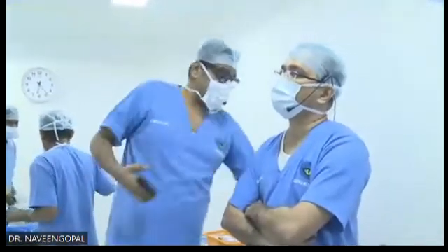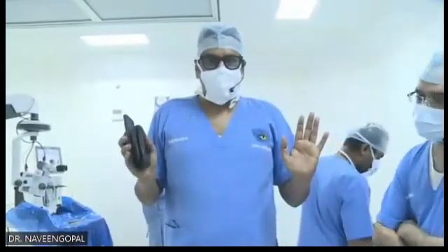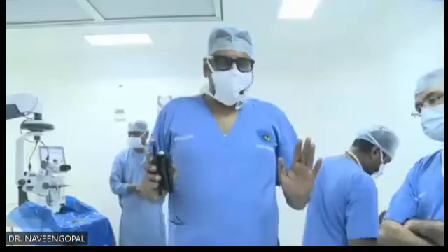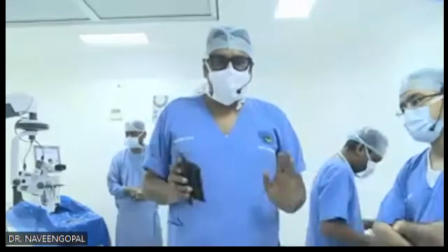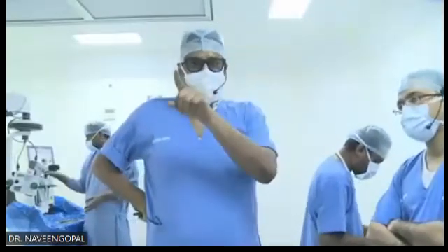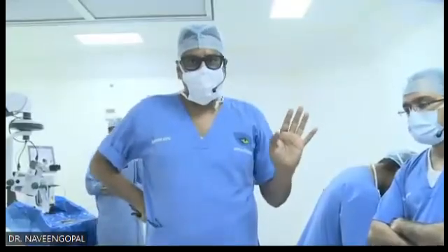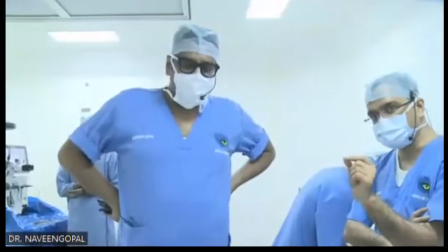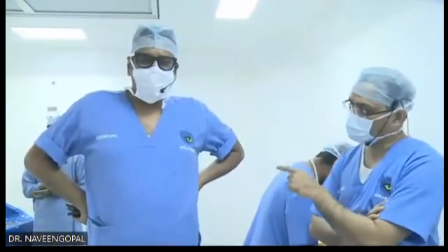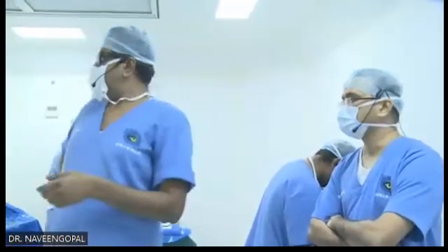See, what is angle kappa? The difference between the visual axis and your pupillary axis. If it is more than 5 degrees, please don't put anything else. Please go for monofocal. Any monofocal will do. If the difference between pupil center and the visual axis is more than 5 degrees, please don't put multifocal. They'll never be happy. If it is less than 5 degrees, you can just slightly decenter based on your Purkinje images. Yes. Thank you.